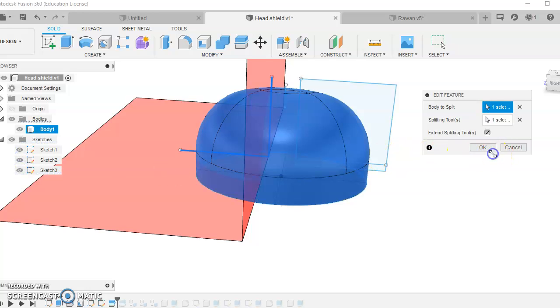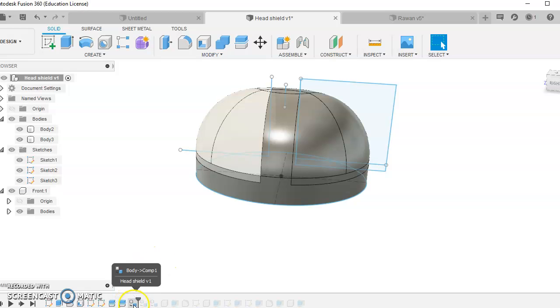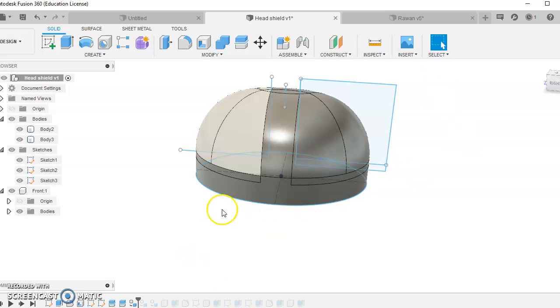When you've done that, you click OK, and that would then split that into another body, so that you could then move that out. Do the same to the other side, repeat the same process. Now once that's done, what I tend to do then is convert all of the bodies into components. I wouldn't do that at the beginning, but now you're getting to a point where you're able to do that. And if you just look at this, if I select that body and then just change it to a new component, it then means that later on I'll be able to move that item. So then they become separate components, and you would label it. In my case, I've labelled one front and one rear. Okay, so we just go to the next bit here.